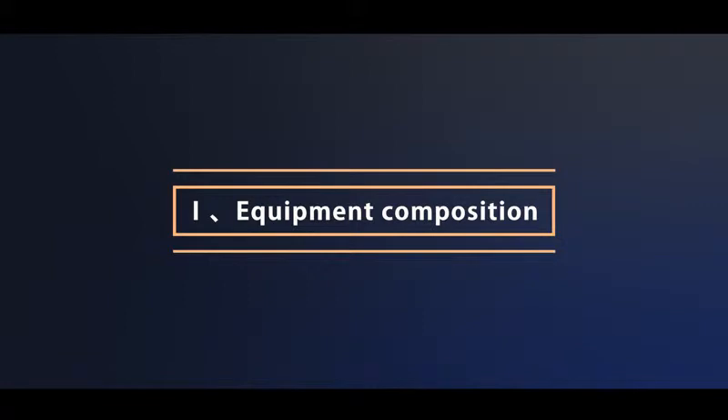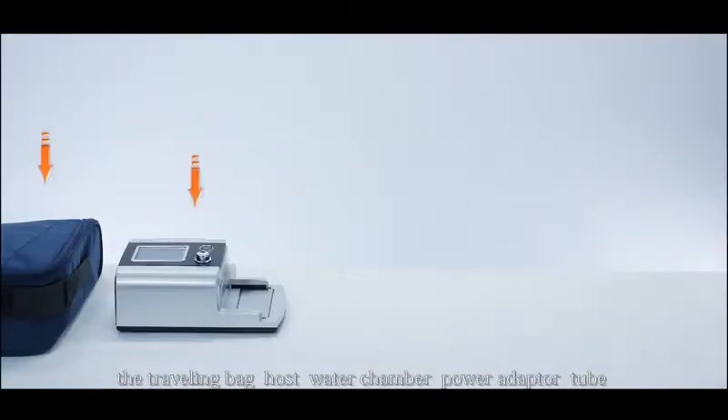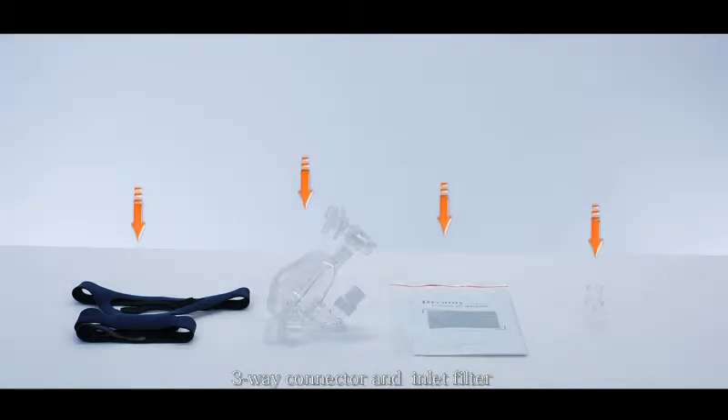Equipment Composition. Our accessories include the traveling bag, host, water chamber, power adapter, tube, headgear, full face mask, user manual, three-way connector, and an inlet filter.